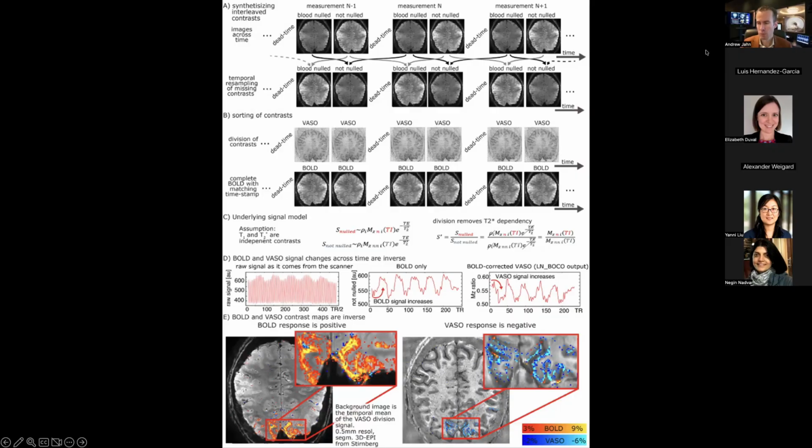So what happens is that this kind of takes away that weighting that happens on the veins with the BOLD effect. So the BOLD effect is largely blood volume, but it's also about the oxygenation level. So when you do VASO, you're kind of doing away with the oxygenation. So you don't really see the veins changing anymore because the venous volume doesn't change so much during activation. It's mostly in the arteries and the arterioles. So it kind of takes away that draining vein effect.